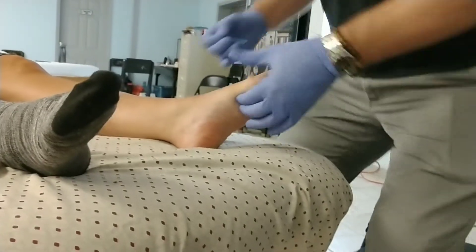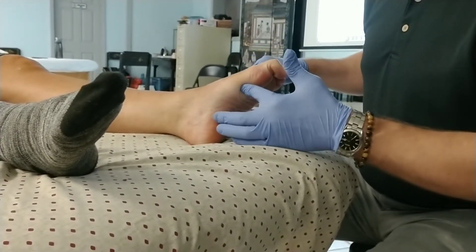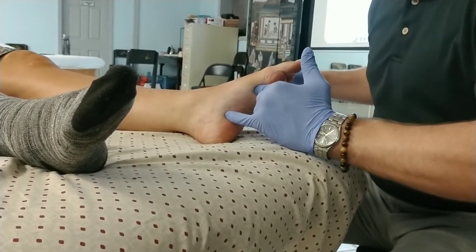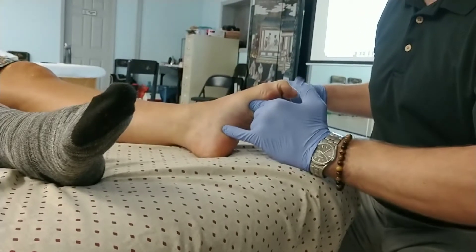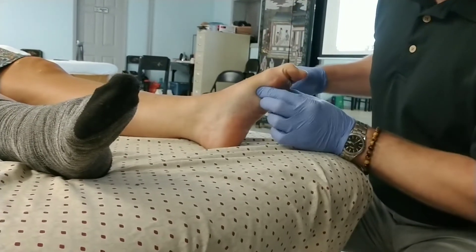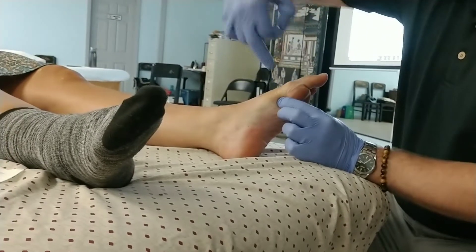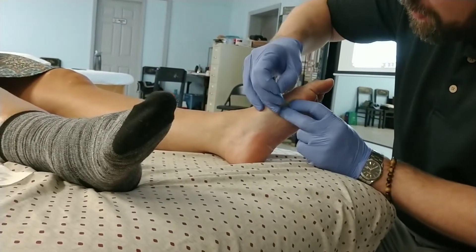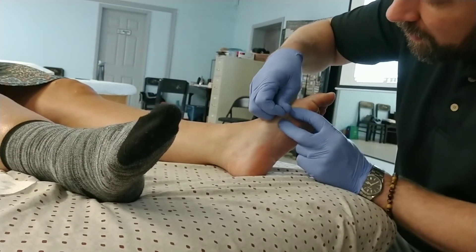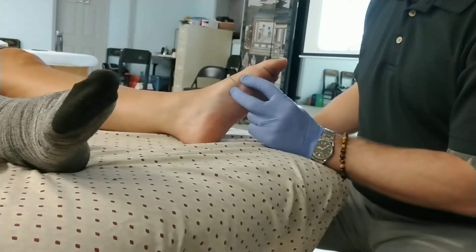From here, let me have you flex your toes down, back, down, back. I'm going to multitask with my fingers and apply just a little hemostasis here from the other needle. So from here I would just do that same medial needling technique. I would come in. There. Got you. Simple enough.